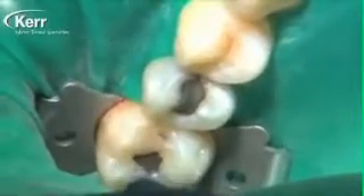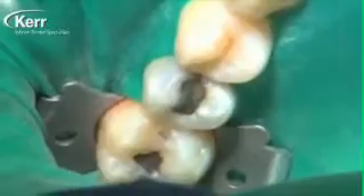One of the great uses for Dyad Flow is as a liner under direct placed composites, and that's what we're going to do here. We'll do a couple of restorations — the first one is a Class 2 direct composite. It's really become common practice today to use a flowable composite under a direct composite restoration, and the benefit of Dyad Flow is that since it's a self-etching flowable composite, there is no separate etching step needed and no separate bonding agent step needed. Dyad Flow bonds to dentin and cut enamel.